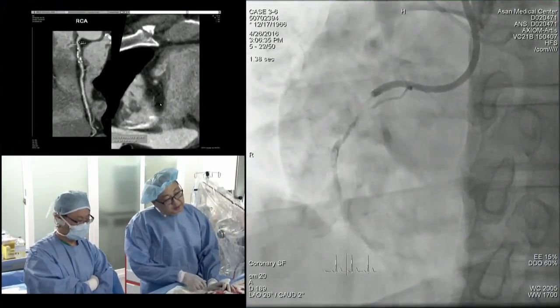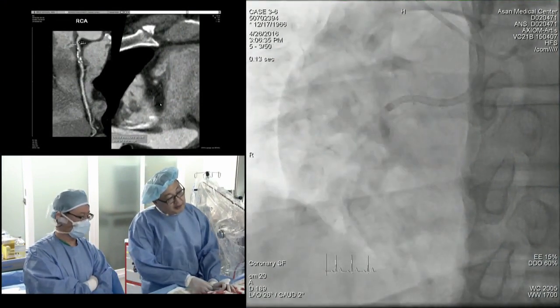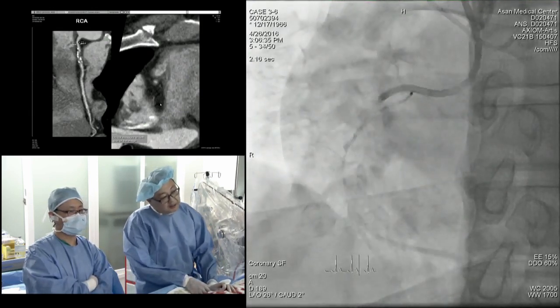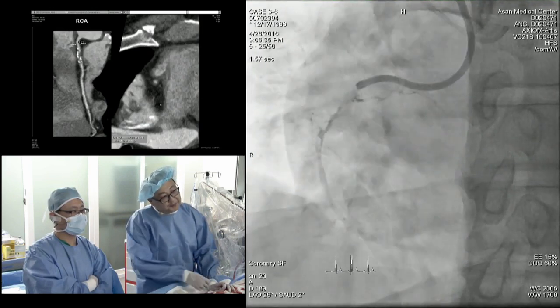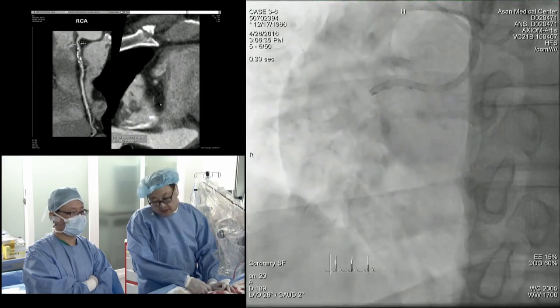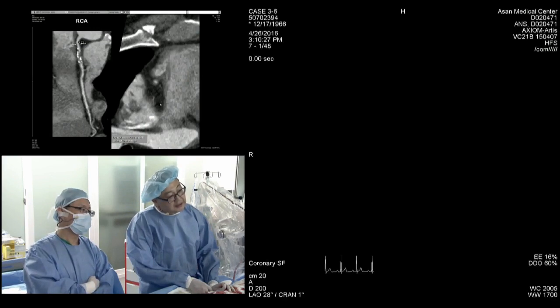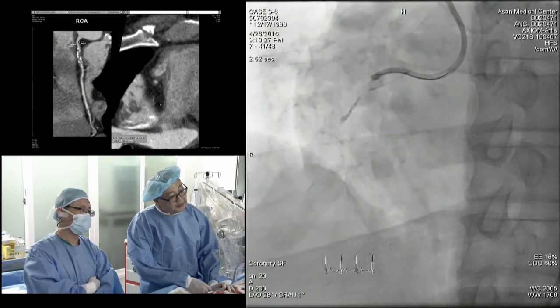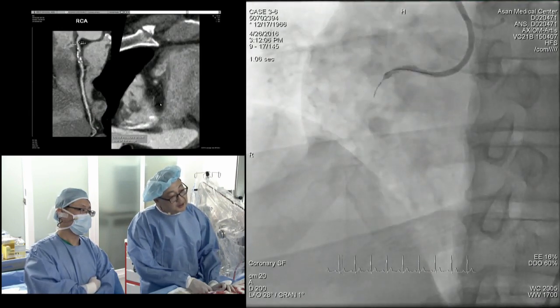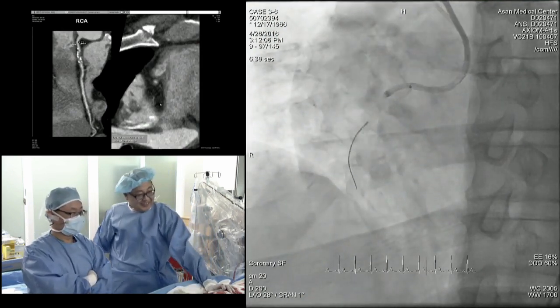The patient is not poor, but however, the guiding catheter support is very, very strong. So I use only a single wire. As Dr. Seung-Woon Rha said, I use a polymer coating wire, Sion Black. Next. Next. Next. This is a real image. This is the magic wire. Yes.